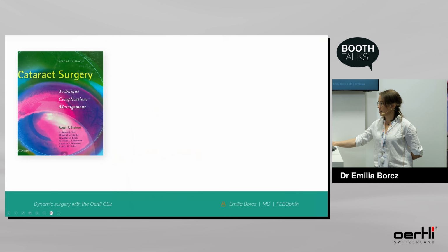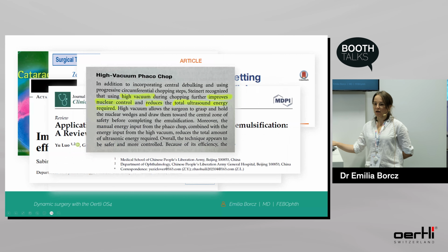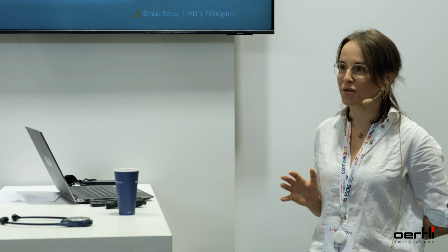In PubMed, we may find a lot of articles and citations, pros and cons of high fluidics. But I think the most important thing is that we feel safe and comfortable with the machine and with the settings. For young surgeons, I can advise you to just enjoy the surgery instead of feeling fear. And my advice is to trust clinical application engineers. These are the guys who enter your OR and try to change your settings, and you are frightened and say no, don't. It was fine, because they really have very high knowledge of the laws of physics, and they really know how it works. Even though we are responsible for the complications, they are really clever.